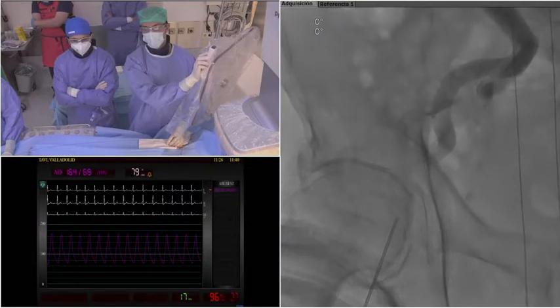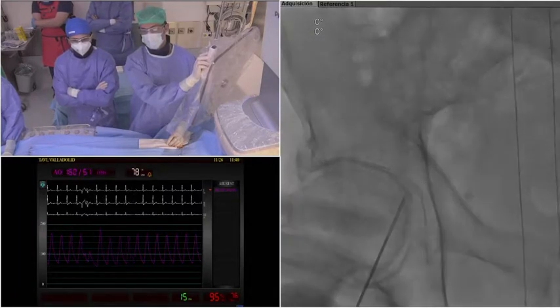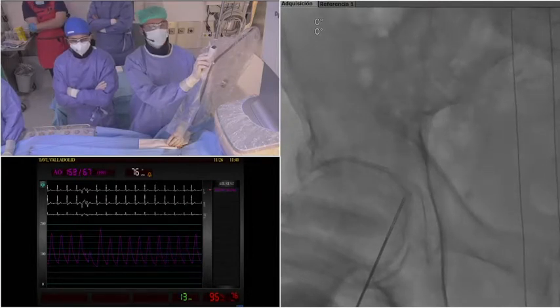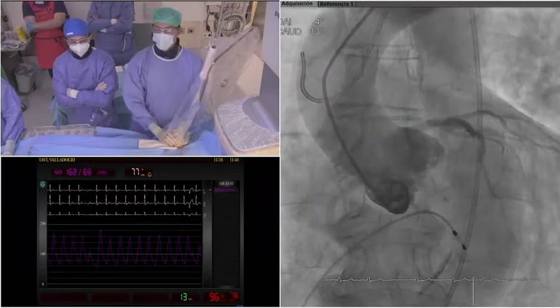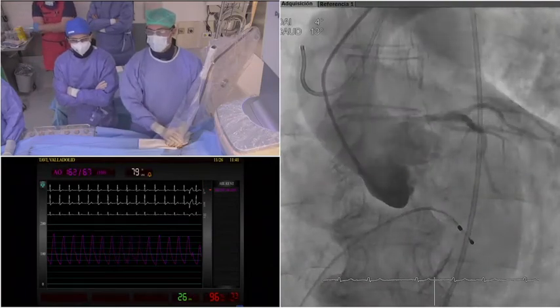So we puncture a little bit higher. This is the right moment of the puncture, right there. And we advance our wire. You see the tortuosity pulls our wire back. Wonderful. And this is the projection that we estimated. As you can see, the alignment of the three leaflets is very good.